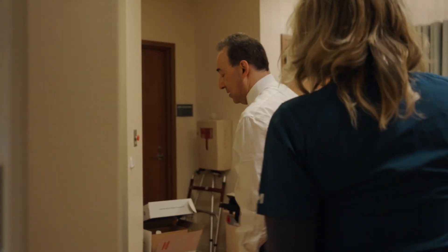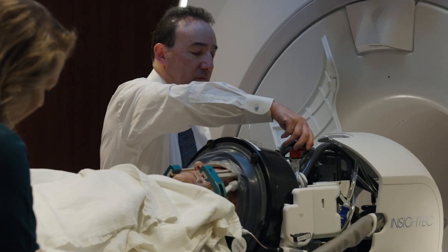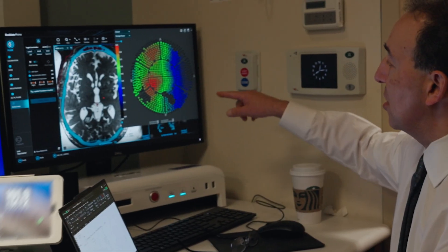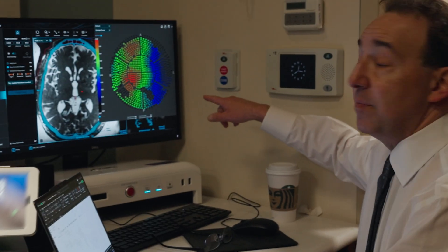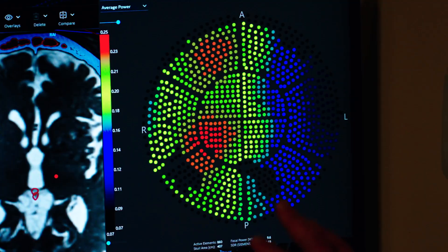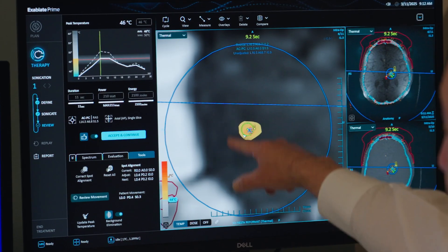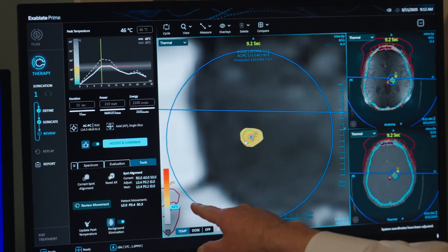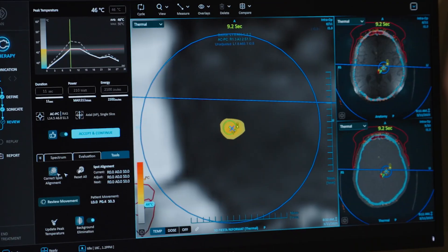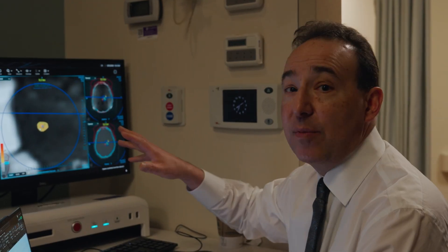We're going to adjust the helmet so that it is centered on our initial target. This is a picture of all the possible ultrasound beams, showing which ones the computer is going to use and which ones it is not. We're now doing calibration scans — the system shows us where it's detecting the temperature and how hot each area is, and then we tell it where we think the center of that really is, which helps calibrate the machine so that it gets better every time we do another test.